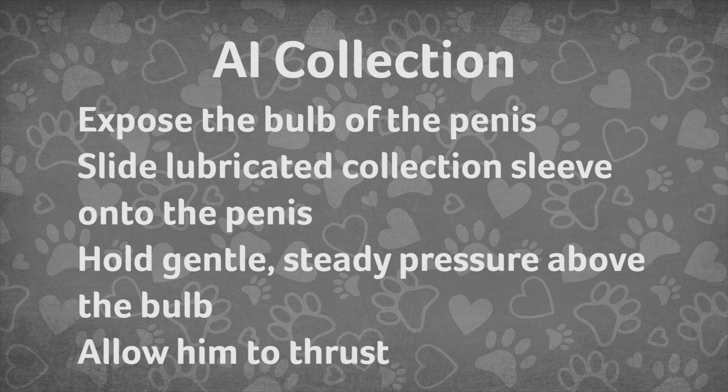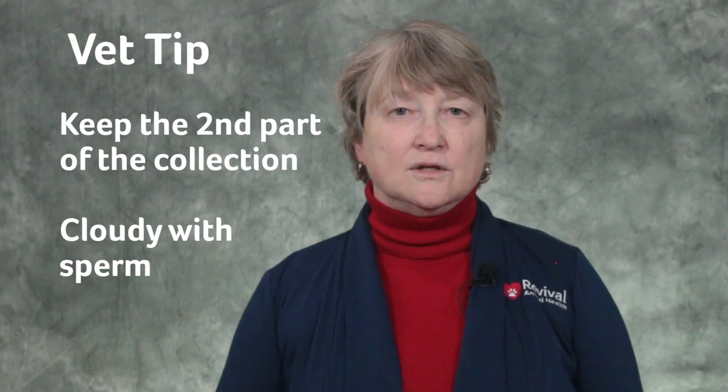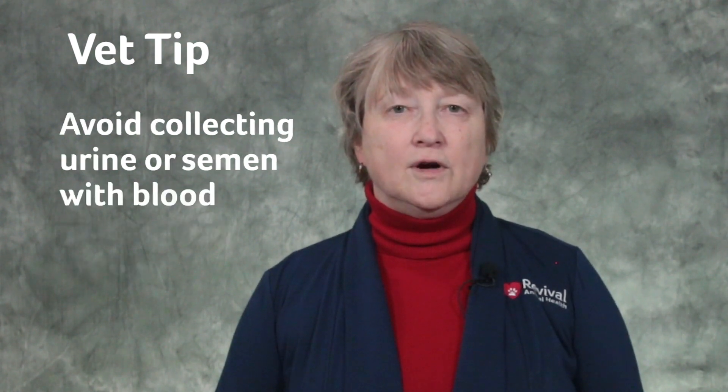Allow him to thrust, or if he needs encouragement, stimulate above the bulb of the penis. The second part of the collection, cloudy with sperm, is the portion of the collection you should keep. Avoid collecting urine or semen with blood.